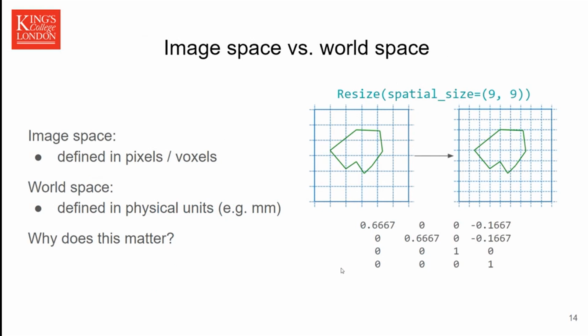So one or two things that should be noted and that you must be aware of if you are using some of the transforms. Some transforms manipulate the raster data, but they don't change the volume of data geometrically. Instead, what they're doing is they're resampling the data and they're changing geometrically the resampling grid. So for example, resize.